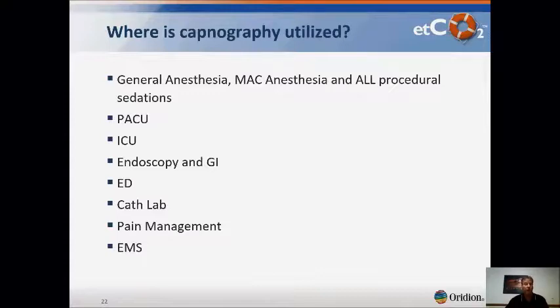Also, EMS, they're always using capnography to verify endotracheal tube placement.